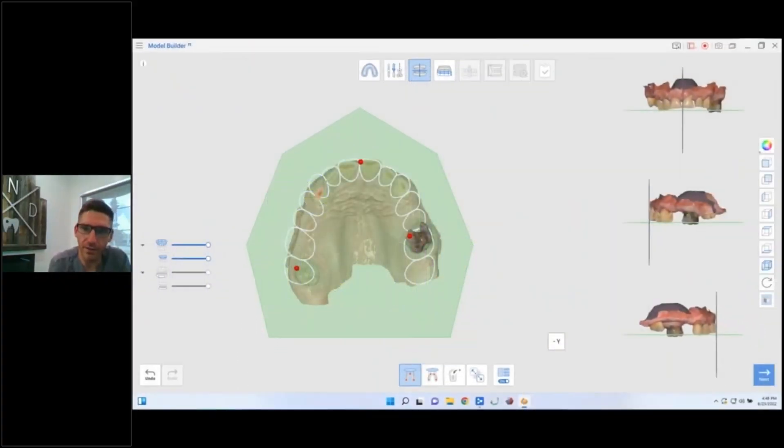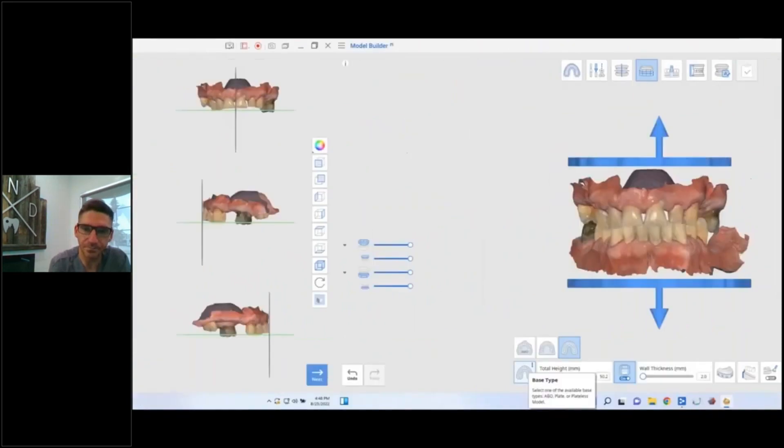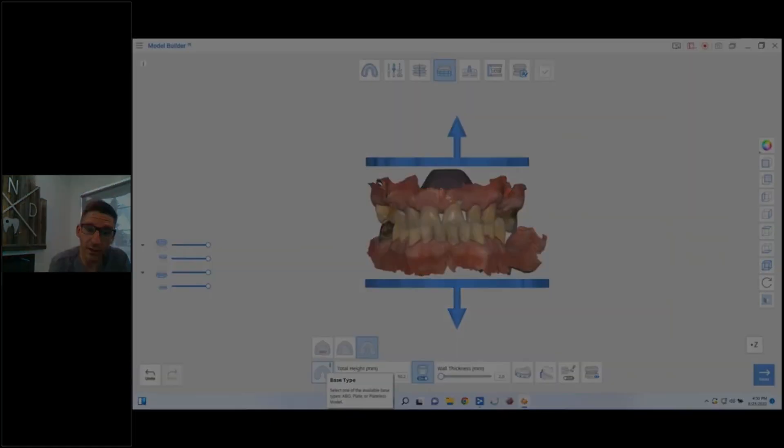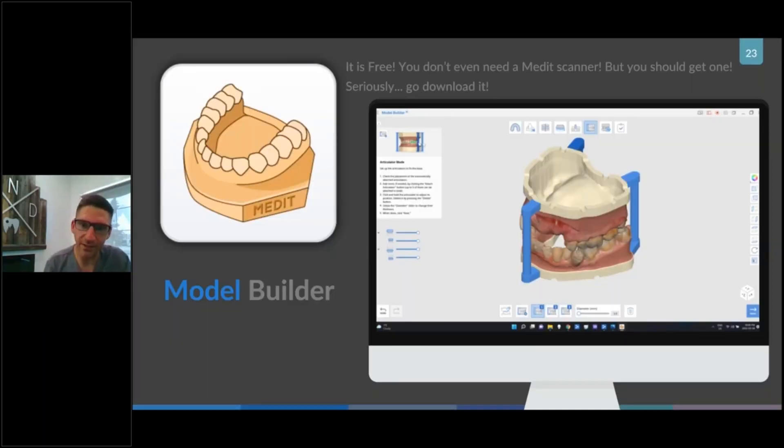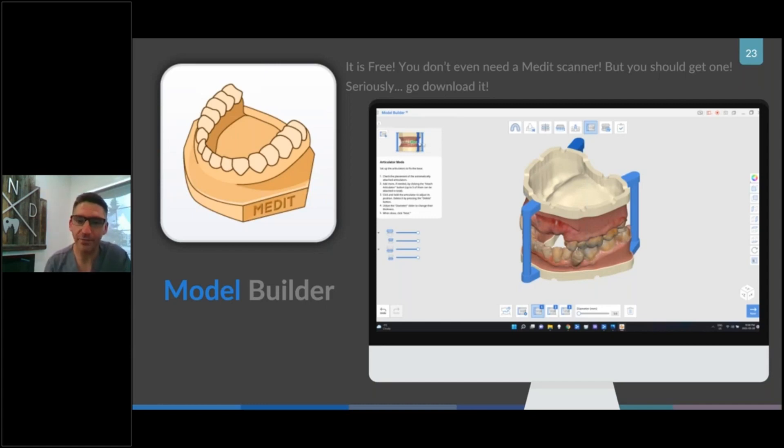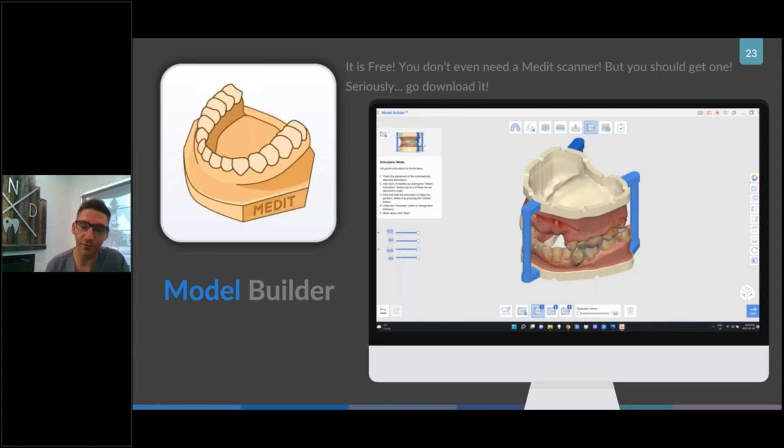Three-point alignment, super simple. Then we're going to use Medit. You can get this software, it's free, go get it. You should get a Medit scanner, I think they're great. But even if you don't, if you already have something else but you're interested in this free Model Builder software, I'm going to show you exactly how to use it even if you don't have a Medit scanner.